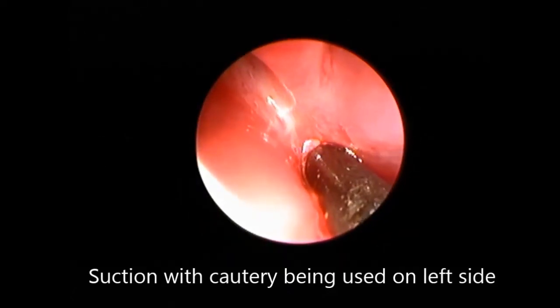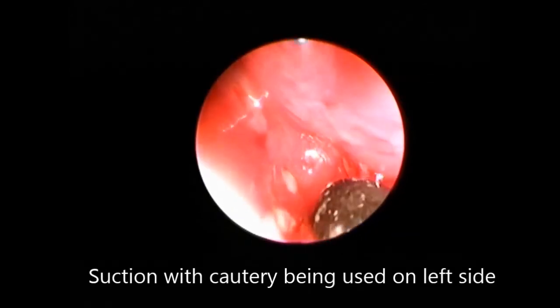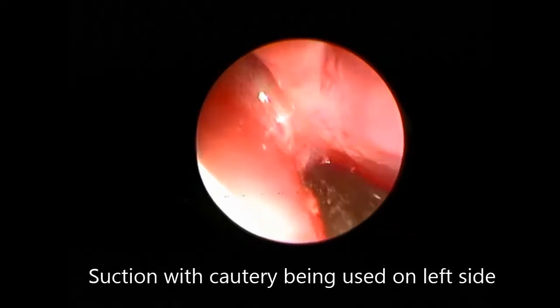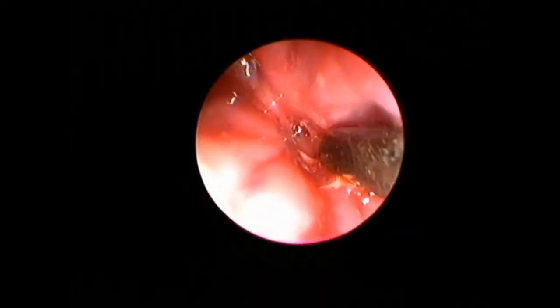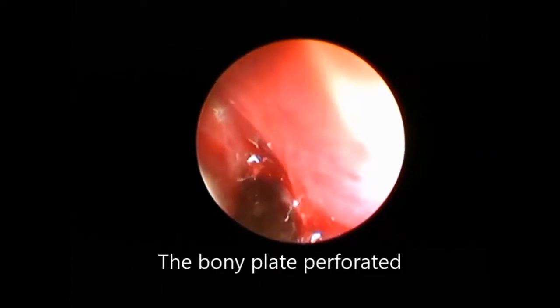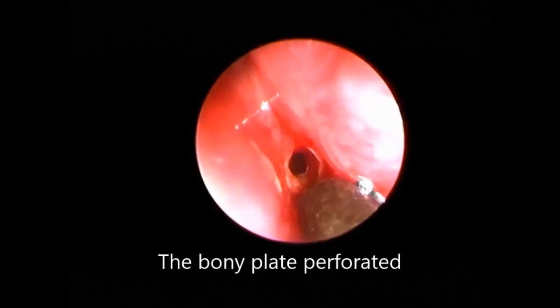First, with the help of unipolar cautery, suction cautery was done and the mucosa was denuded. Then the bone was punctured with steady pressure from the suction. The entry into the nasopharynx was achieved — you can see the air bubble coming.